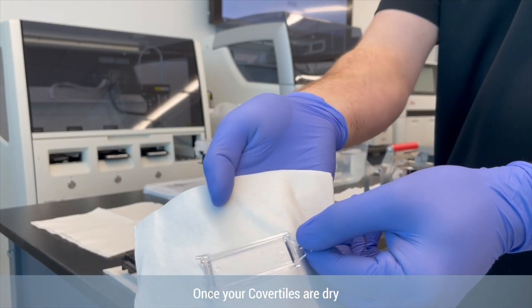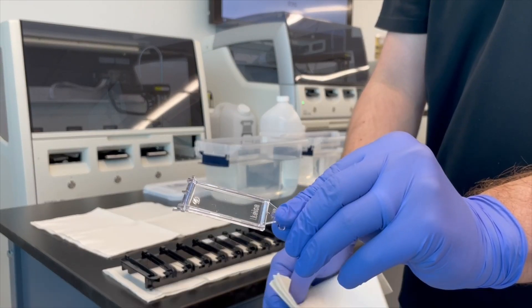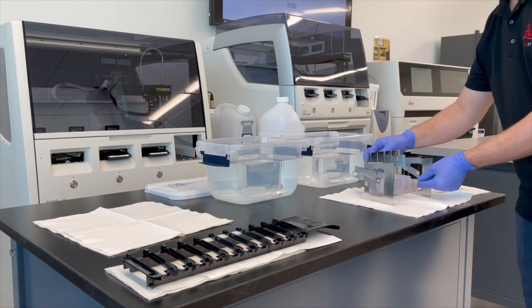Once your cover tiles are dry, they are ready for their next use. Replace cover tiles after 25 uses or earlier if visibly damaged, significantly discolored, or staining quality deteriorates.